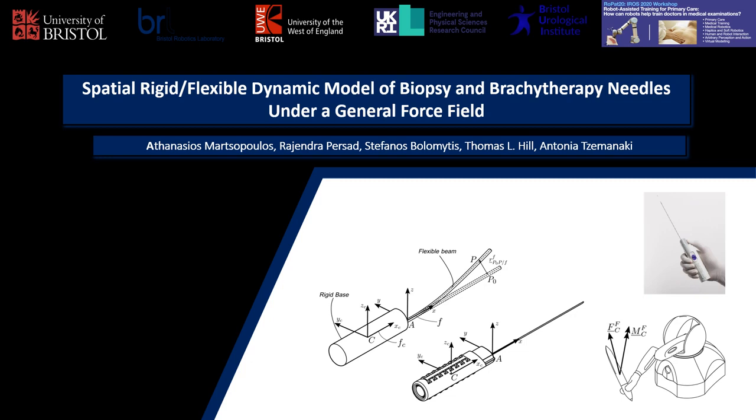This paper presents the development of a spatial, rigid/flexible dynamic model of biopsy and brachytherapy needles under the effect of a general force field. Percutaneous needle insertion constitutes one of the main practices for performing minimally invasive operations and covers a plethora of diagnostic and therapeutic applications such as neurosurgery, deep brain stimulation, and prostate biopsy.